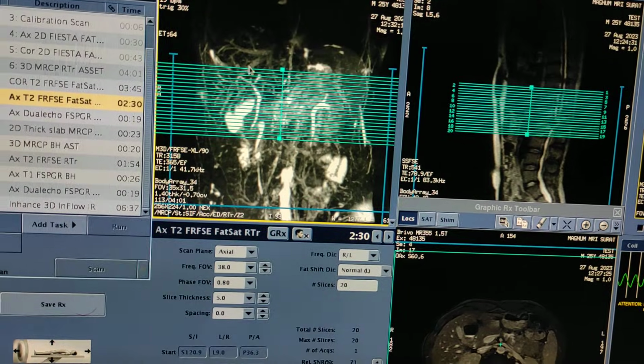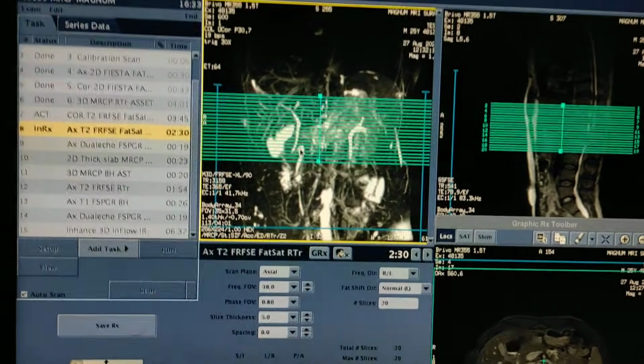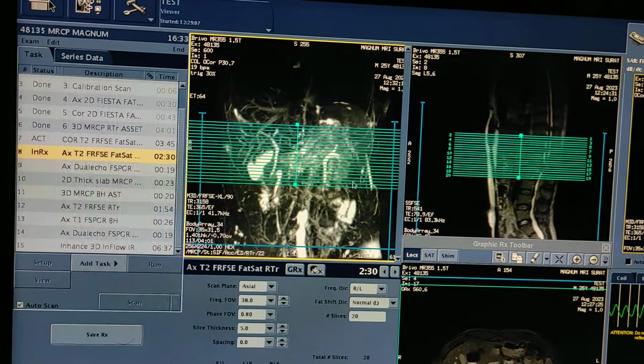Now you can see over here, here is the CBD, here is the gallbladder. This much area you have to cover. Automatically the pancreatic duct is going like this, so you have to cover this much area.